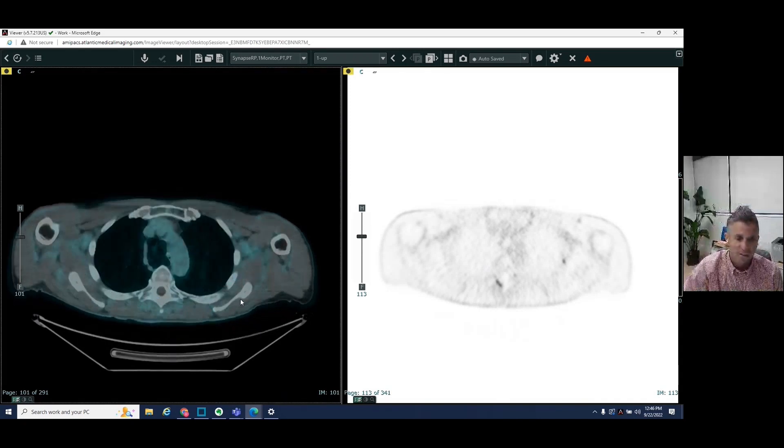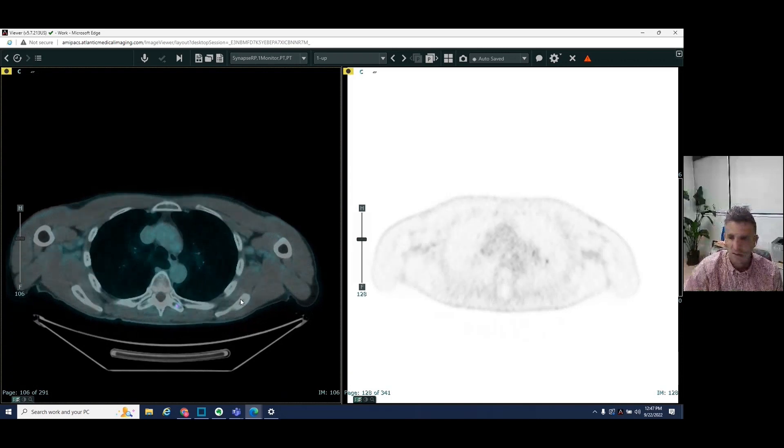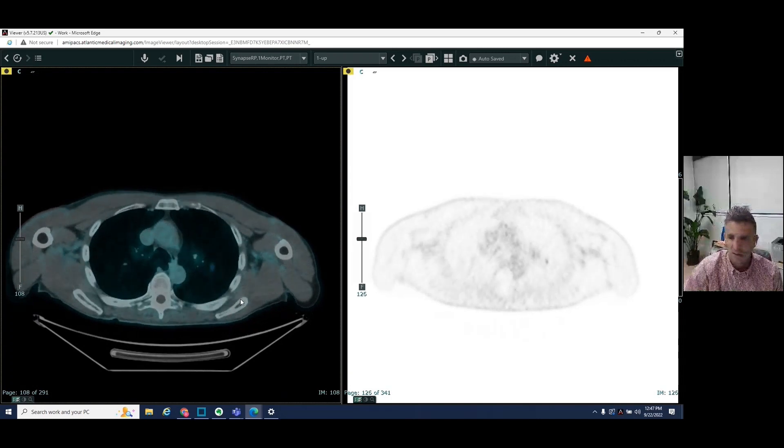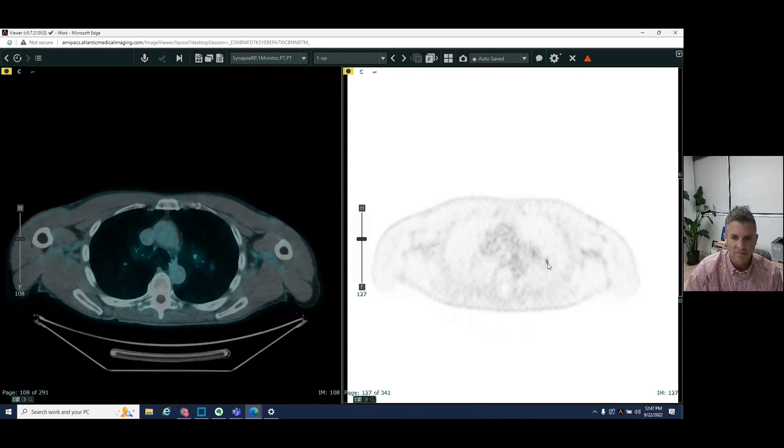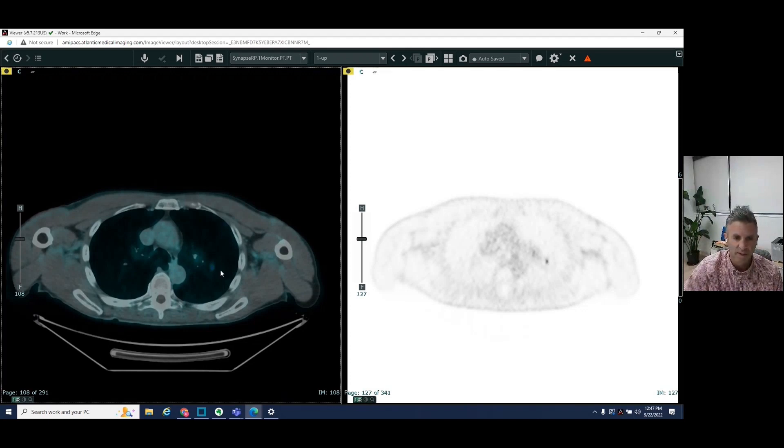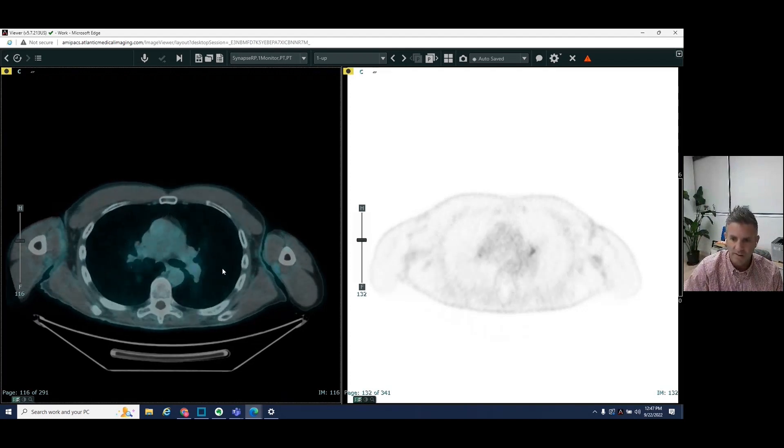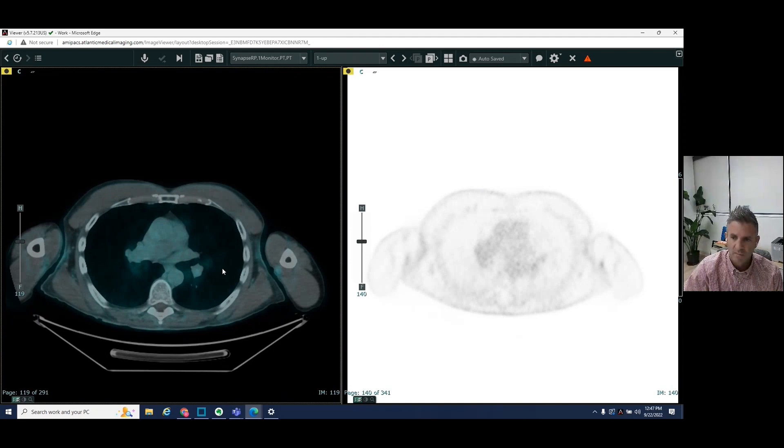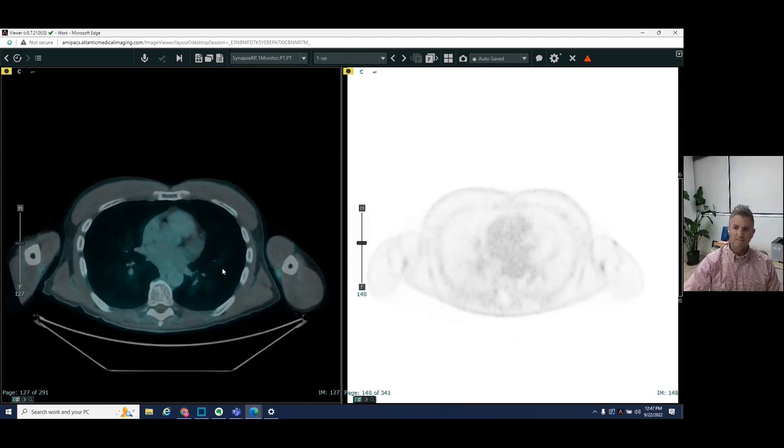We see this tiny dot here, which is in the left lung. So this is a metastatic pulmonary nodule. We see other areas in the thoracic spine.